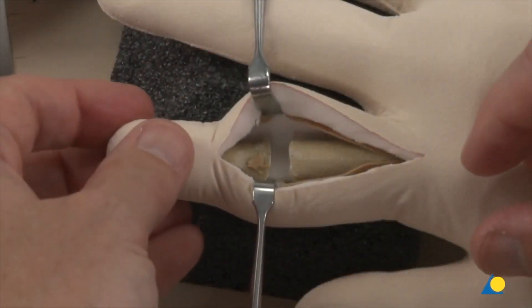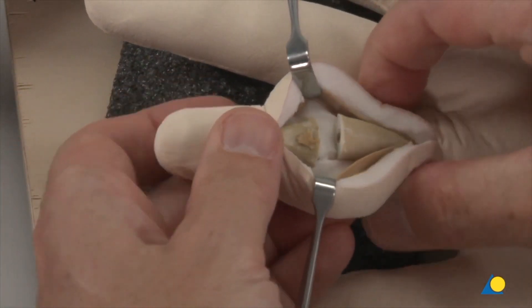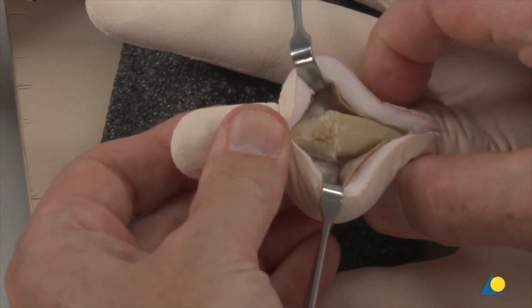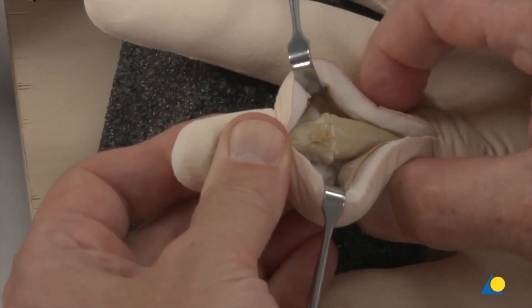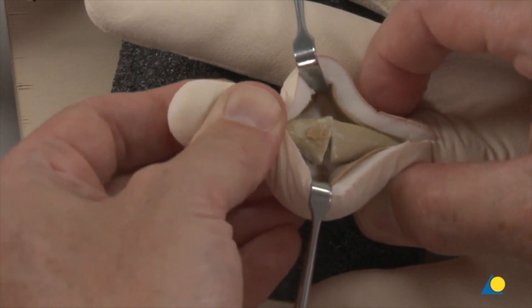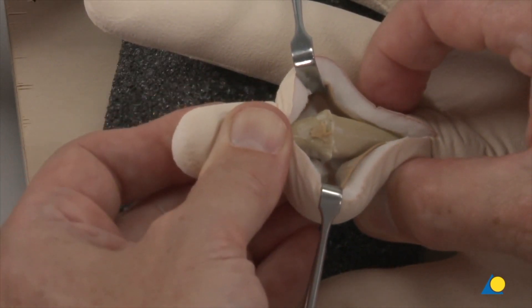By putting the two flat osteotomy surfaces together, the intended angulation in flexion is checked as well as the angulation in both ulnar and radial directions. The osteotomy surfaces can now be aligned.